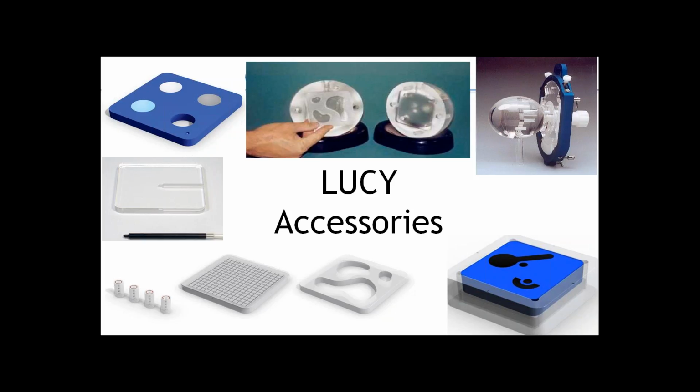going counterclockwise, an ion chamber insert, CT inserts, including our spatial distortion grid and our markers. We have an irregular volume-shaped insert down there on the bottom, as well as our MRI insert, and on the bottom right there is the organ at risk insert, so we can rigorously test the treatment planning system. And we'll talk about each of these in specific as we go through here.